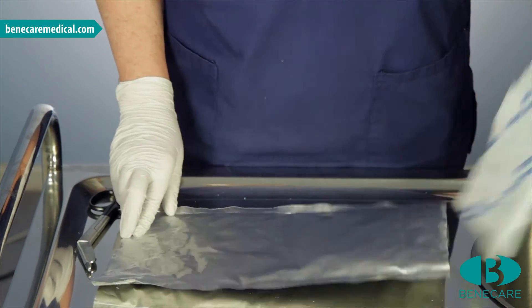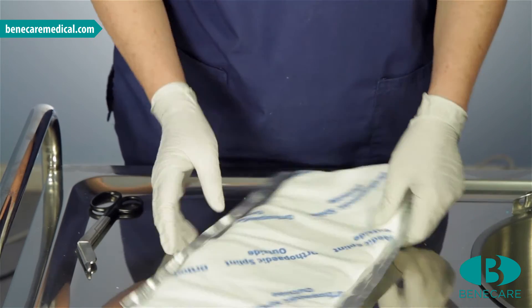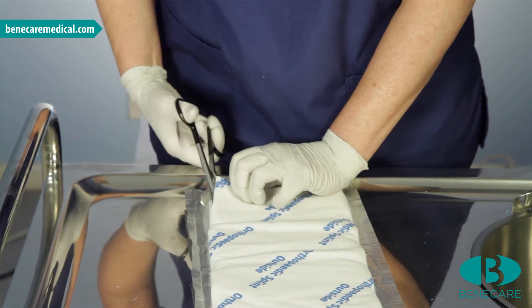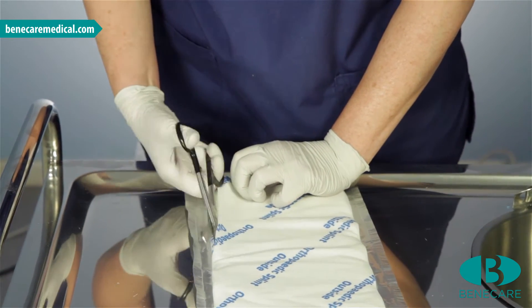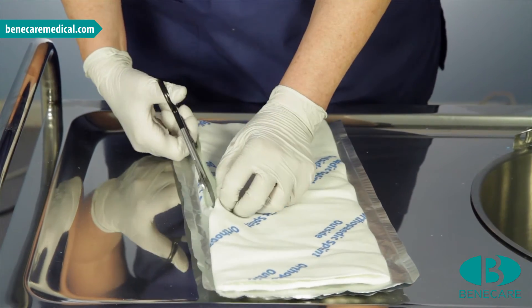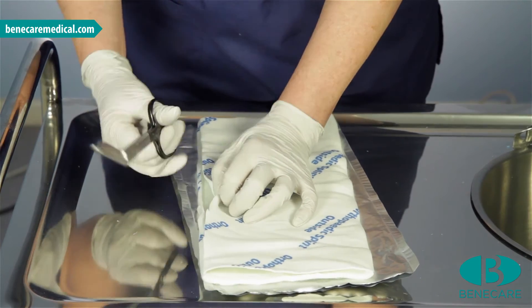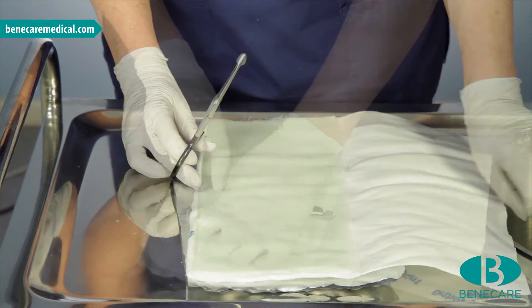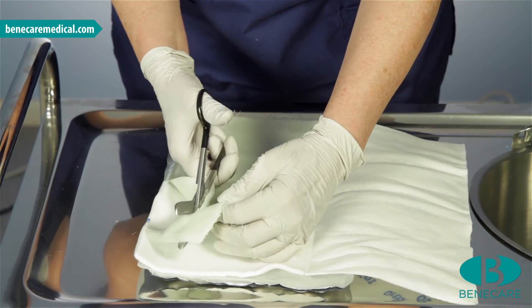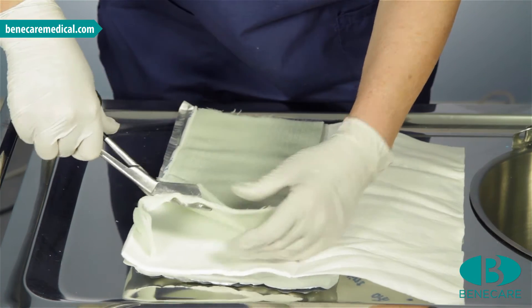Remove the splint from the pouch and position with the writing facing upwards. Please note this should be positioned away from the patient during the application. Cut along the padding exposing the splint. At the distal aspect, trim the splint to fit into the web space of the thumb and to fit a minimum of 1 cm within the padding.